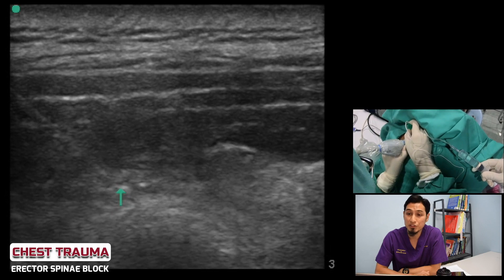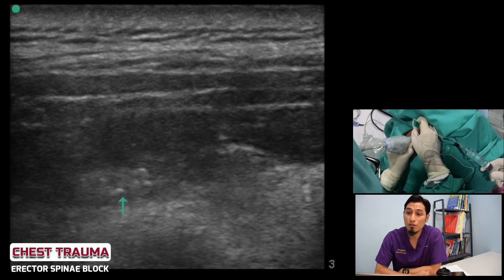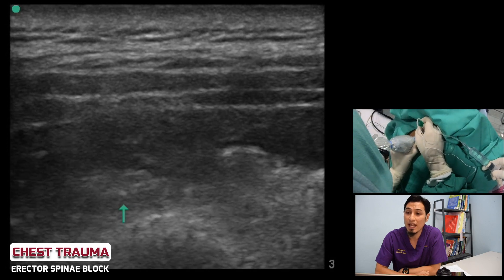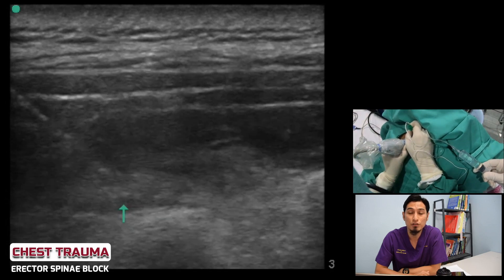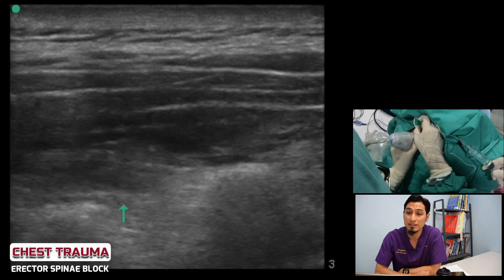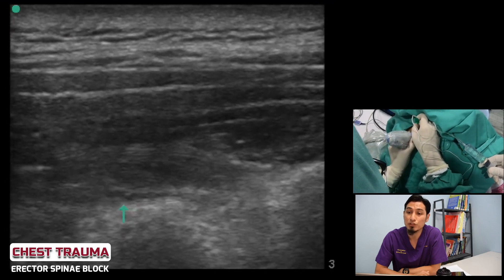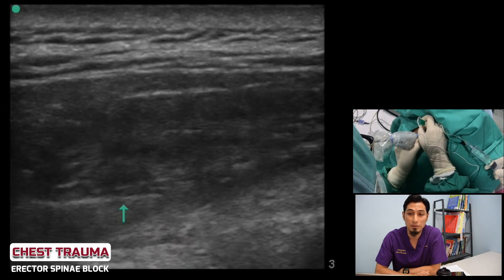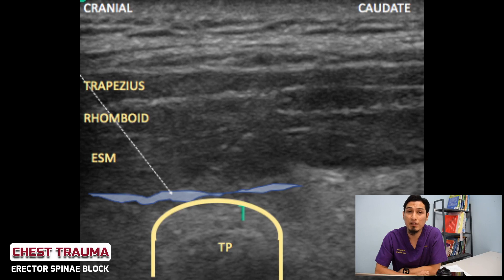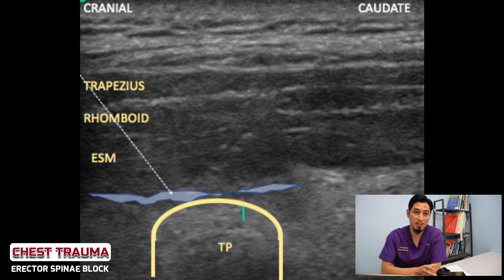This block produces multi-dermatomal analgesia for the trunk — anteriorly, laterally, and posteriorly. From previous studies and case reports, coverage of 4 to 5 dermatomal levels up and down from the injection point is typically produced with 20 to 30 ml of LA, although spread can be variable. Here we show the spread of the LA, moving the transducer carefully until the spread ends and then moving caudally. Thank you.